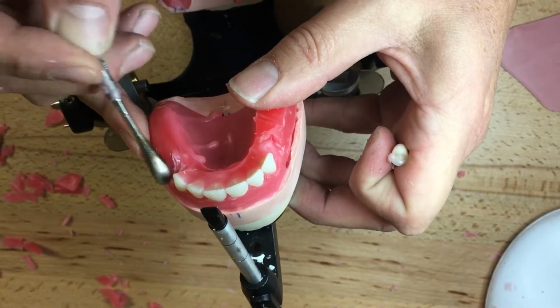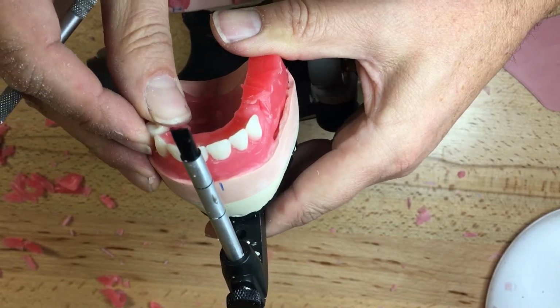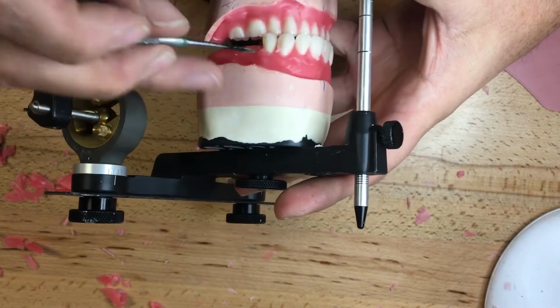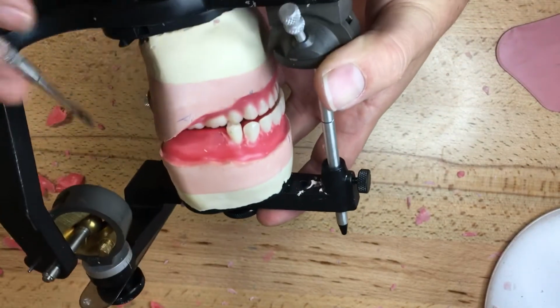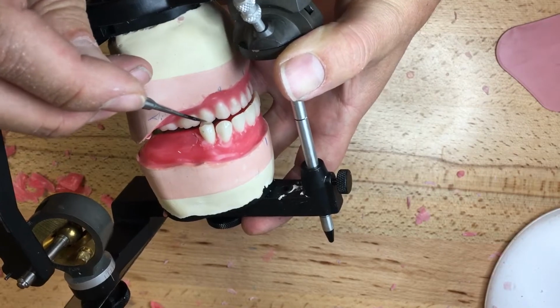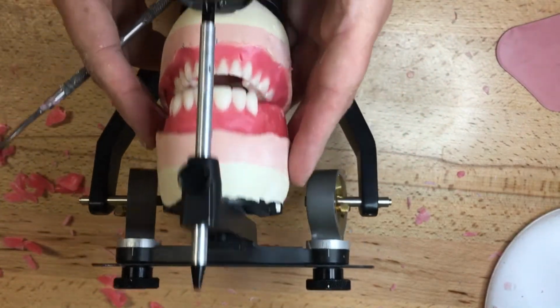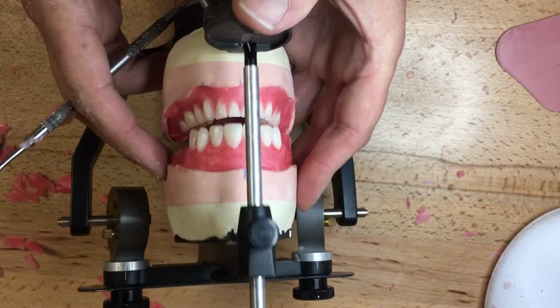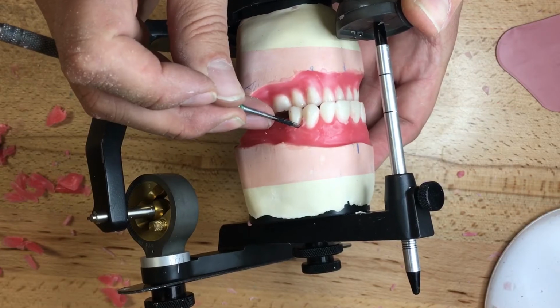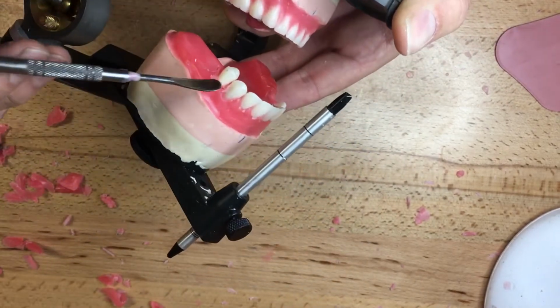I'm just going to soften the wax again. Let's see if I can achieve lingual cusps. There we go. So I have it open in the posterior, in the overjet here. I have this open of the buccal overjet. If I look here, I've got the right plane of occlusion. I'll move it slightly a bit more. And I'll move on with 6 and 7.